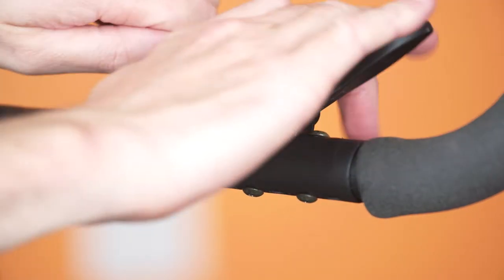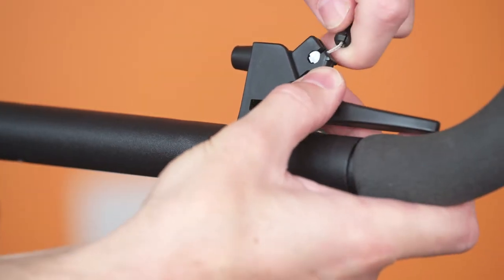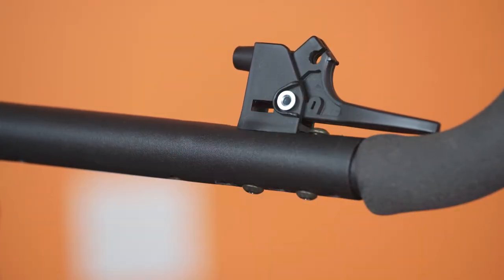If fitted, the push bar width must be adjusted, which will require removal of the tilt trigger. Remove the tilt cable from the trigger assembly.